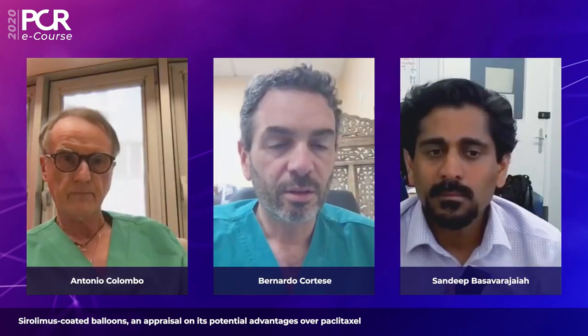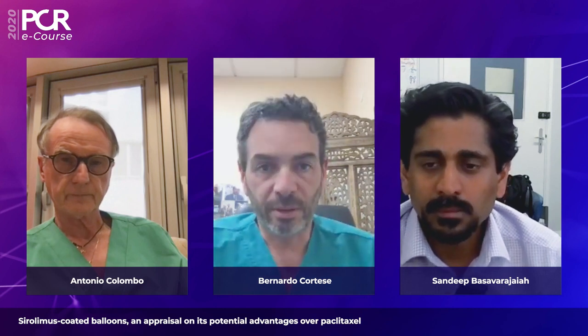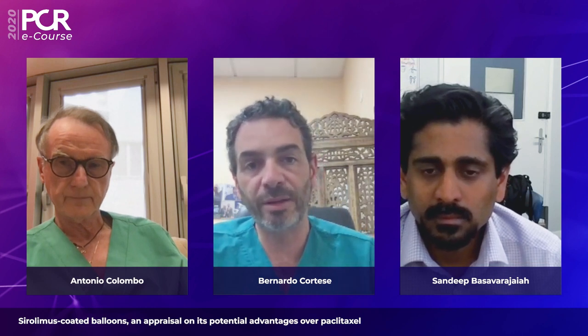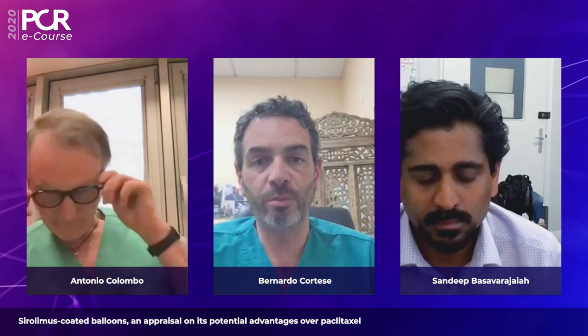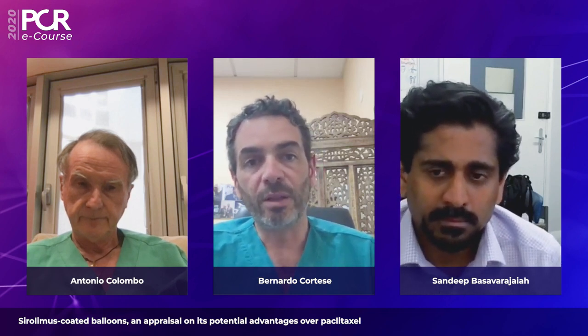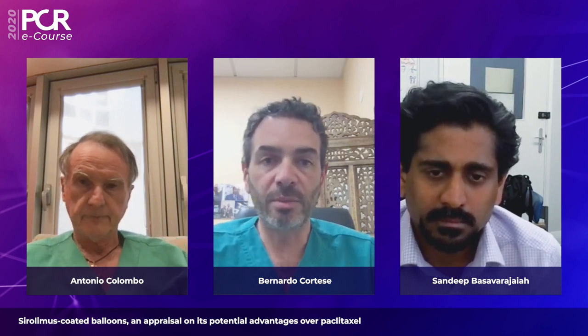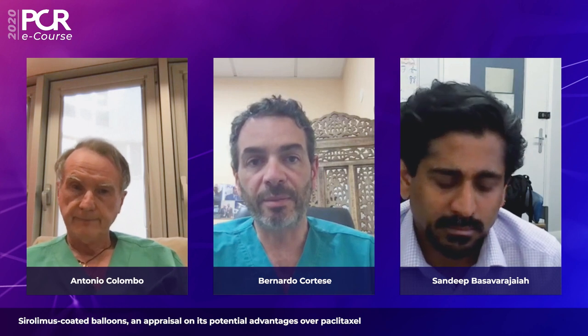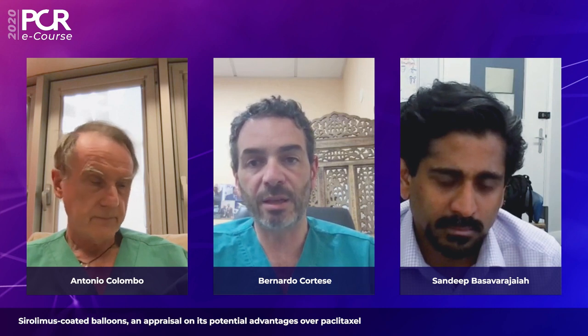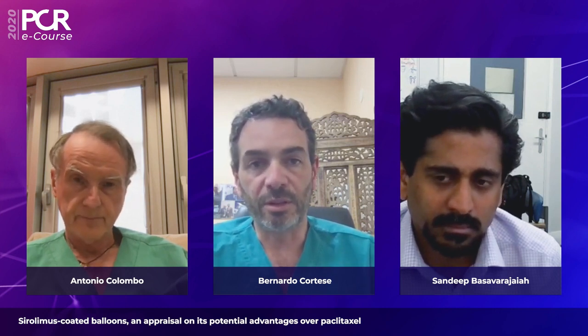Thank you very much. Okay, so thank you, Sandeep. Antonio, we have seen very beautiful cases with this device, and I think you have underlined some of the key messages for when we have to face DCB PCI. The first one is that it is really key to correctly prepare the lesion, and Antonio has shown us how this is clearly correlated with the failure or not of the DCB PCI. The second point underlined by Sandeep is that you should keep the stenting rate, with any type of stent, as low as possible after DCB.